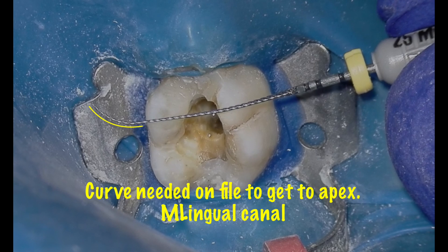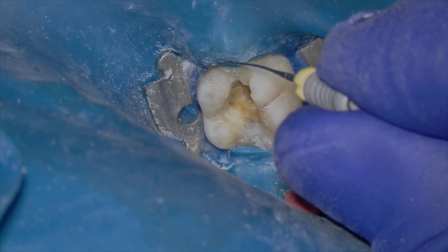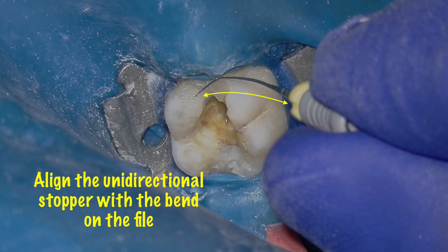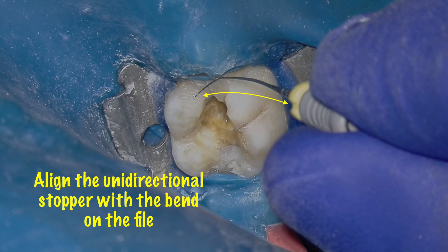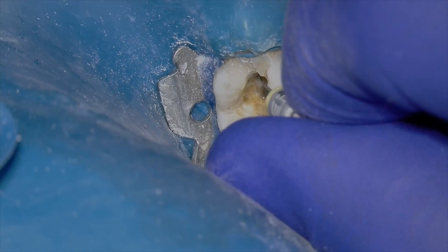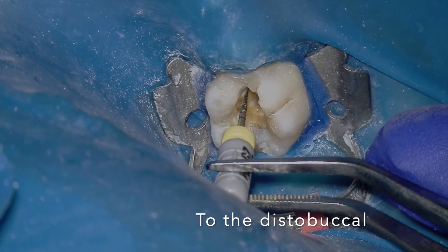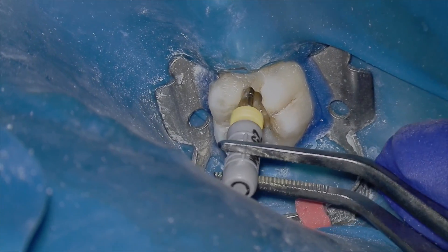This was the curve I needed to put on the file to get to the apex. I'm lining up the little yellow uni-directional stopper with the bend of the file, and then I can figure out which way the canal curves. Watch when it goes back in the canal — it's just a minimal angle, and that groove is actually facing this way. The file just slides right down.